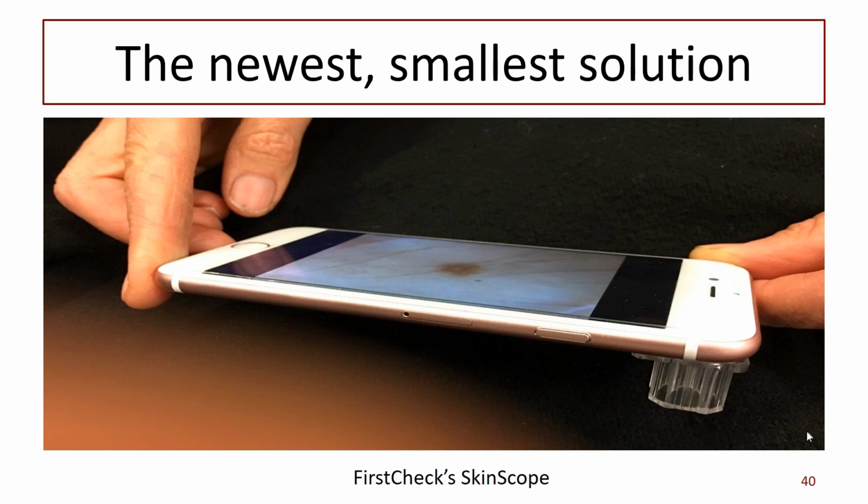Now, it's not designed for doctors. It's for consumers. So the expectation is that you will actually sell or give these to your patients at high risk, or the ones that keep coming every third week with another spot for you to look at. Say, right, why don't you use this, take photographs, send them to me by email, and I'll let you know if you need to come in and for me to have a closer look.